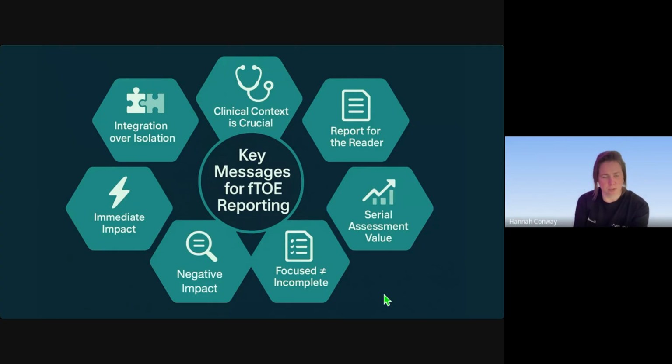And we always need to be aware that there was a recent coroner's case about a transthoracic echo where something significant was missed. If you're doing a TOE on somebody, you want to bet your bottom dollar that it's completely reported to the max so that you can protect yourself medicolegally, let alone do the right thing by the patient. Those are things you need to be aware of with the current climate that we're seeing.